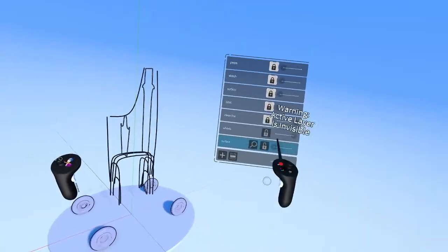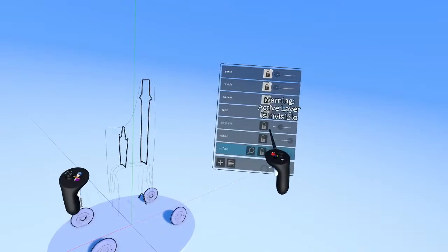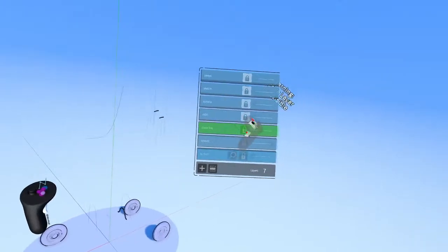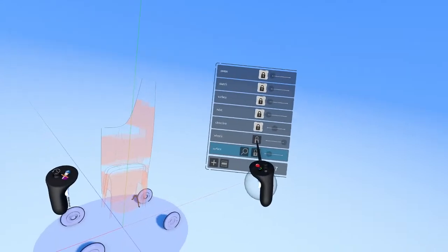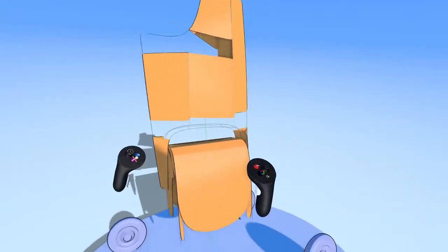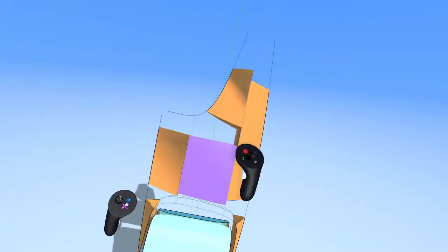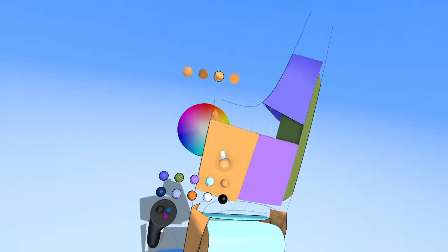Okay, great. So now we have our wheels on a separate layer, our curves on a separate layer, and our surfaces on a separate layer. So let's lock the lines, the wheels, and leave just the surfaces open to be worked on. So as I said before, these are all separate surfaces, and I'm going to demonstrate that by just changing them to be different colors. And then show you what it looks like when we connect them together.